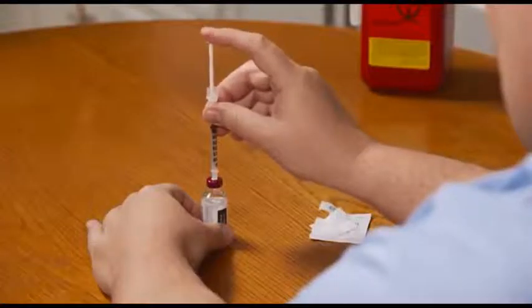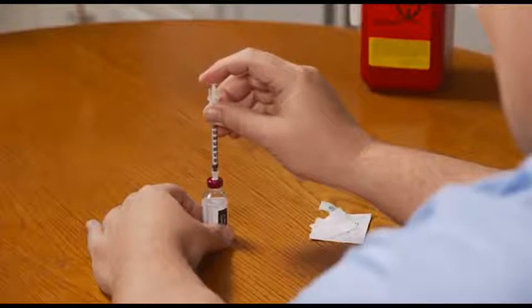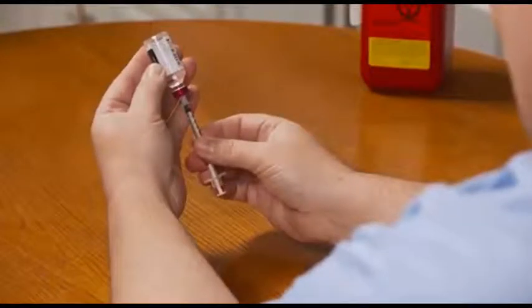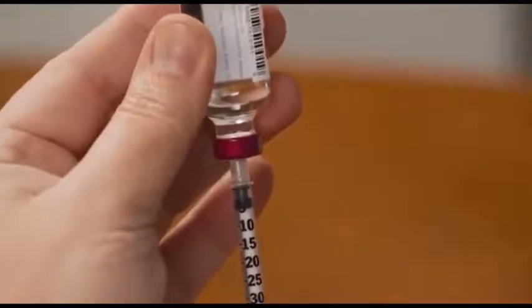Then, slowly push down on the plunger to push the air in the syringe into the bottle. Now, with the syringe still in the bottle, turn both the insulin bottle and the syringe upside down so the bottle is on top of the syringe. Make sure the needle tip is below the level of the insulin left in the bottle. If the tip is above the insulin level, you'll need to pull the needle out a bit.